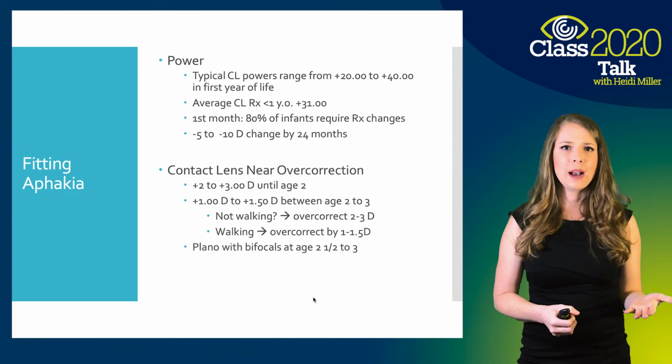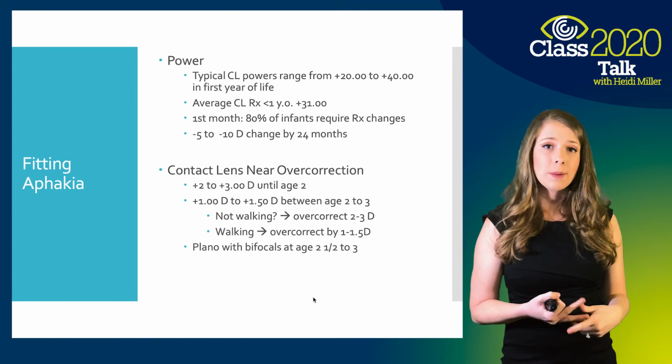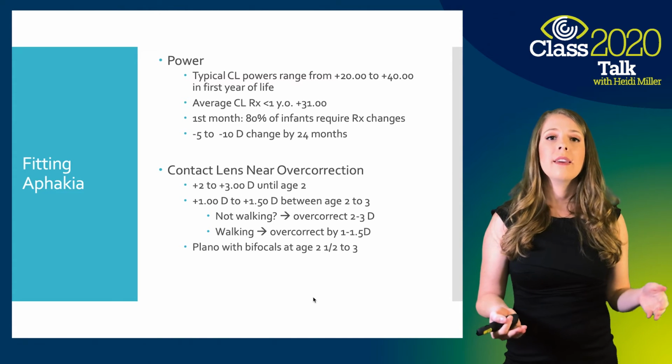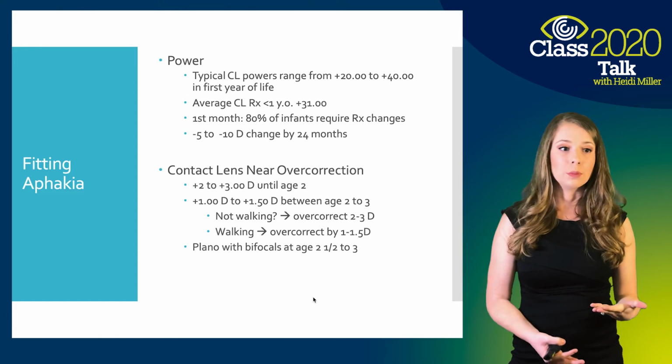Those are things to keep in mind when you're discussing follow-up care with the families, and the importance of coming to their follow-ups. Not only is it to make sure that they're still doing well with the contacts, but it's also important to make sure that we're changing powers accordingly so they're getting the best vision possible.